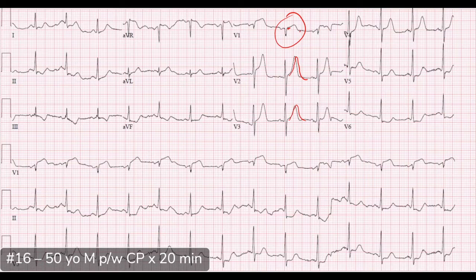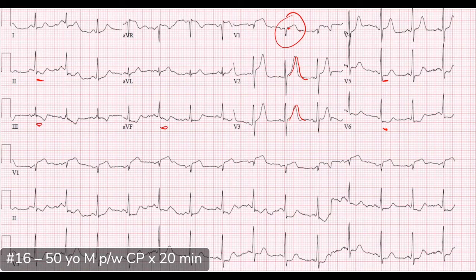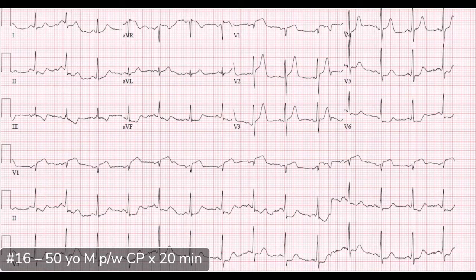Continuing more laterally, we see ST depressions in V5 and V6, and also depressions inferiorly in leads 2, 3, and AVF. While this might not meet standard AHA STEMI criteria, this is clearly an occlusive MI, especially given the symptomatology. The cath lab was activated, and they found a proximal 100% LAD occlusion.